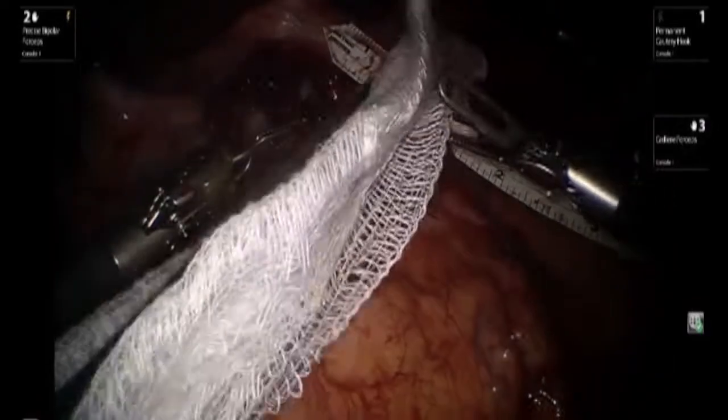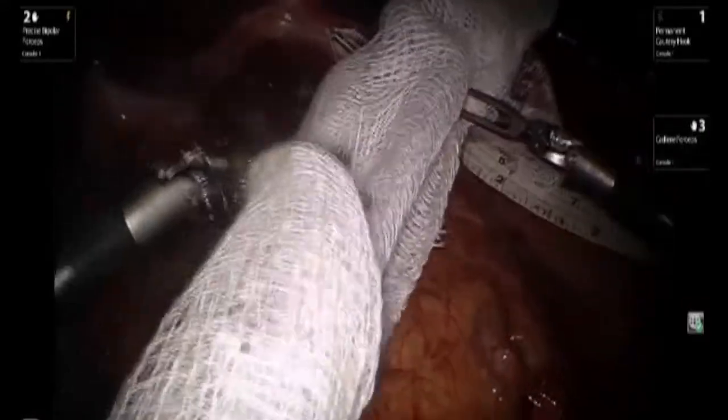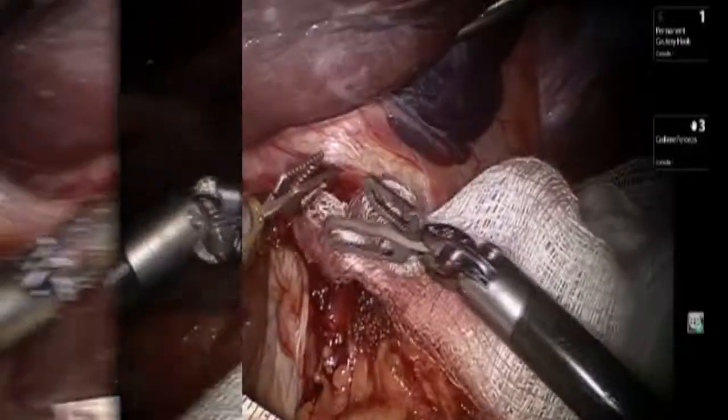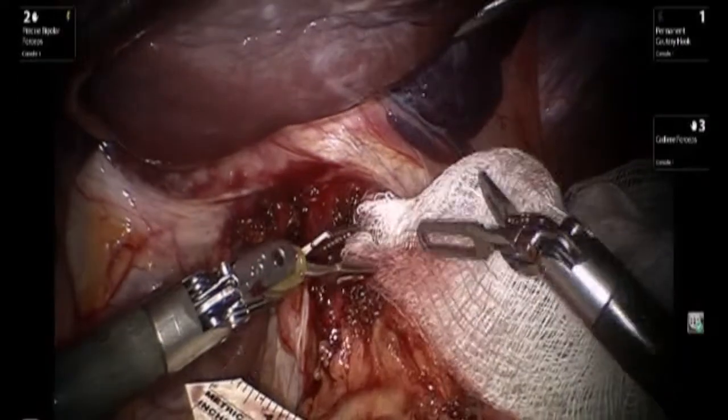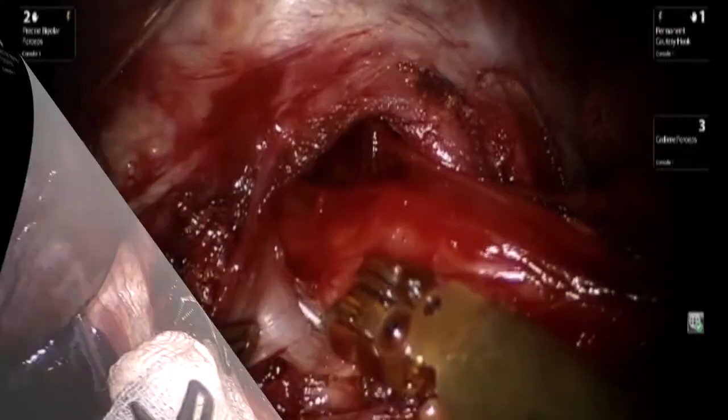If any bleeding is encountered, it's generally advisable to utilize a piece of gauze to control that bleeding, and to minimize the use of cautery and the subsequent risk of burn injury.